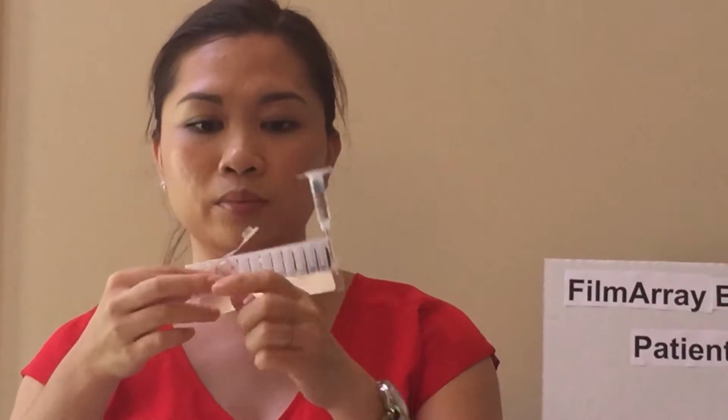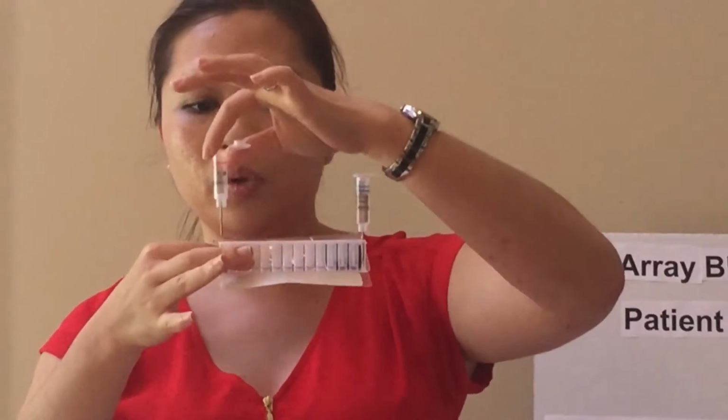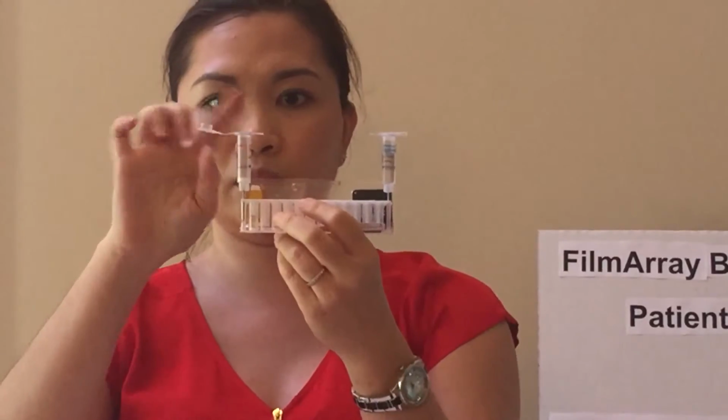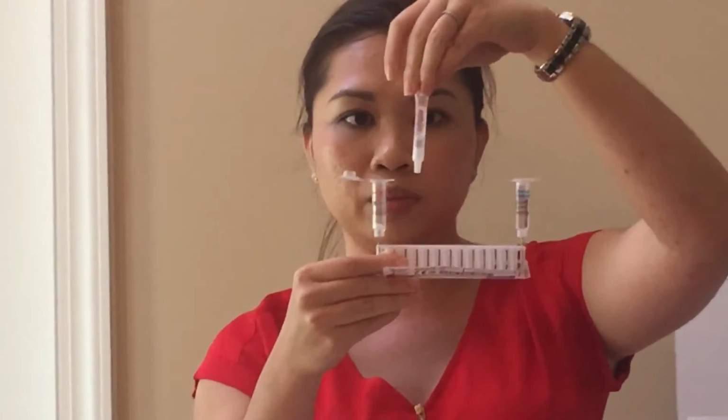Onto the red part, which is the sample mix part, you have something similar, a sample vial. I'm going to put this in here. Notice that this part is open. On the red part, which is the sample mix, you're going to have the sample buffer.